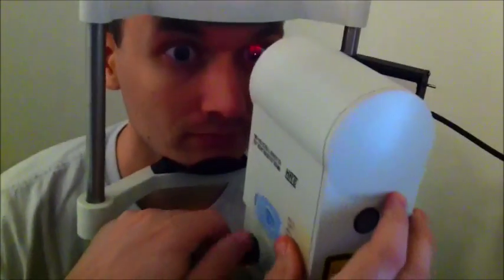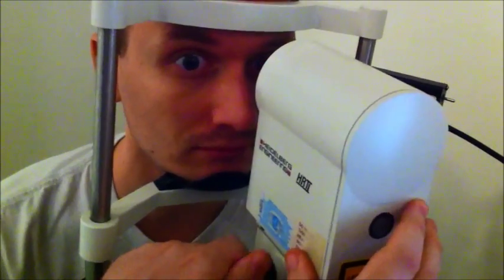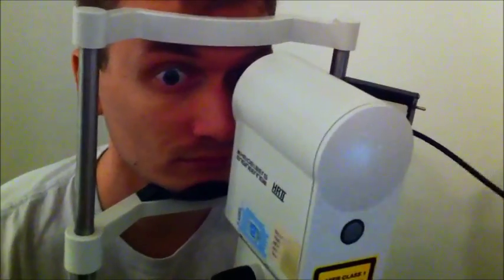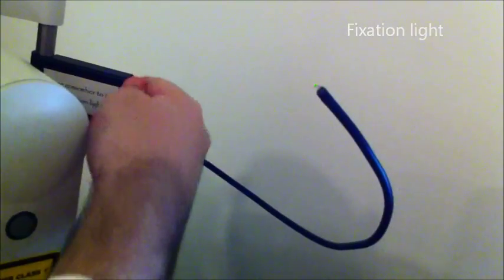The laser should start up, and when you're moving it forward, you want to ask the patient to look off to the right of the box, looking for a little green light. So there should be a fixation target. If you have a patient who's an amblyope who can't fixate properly, there is an external light that you can use, and you can turn it on or have it as a flashing light.